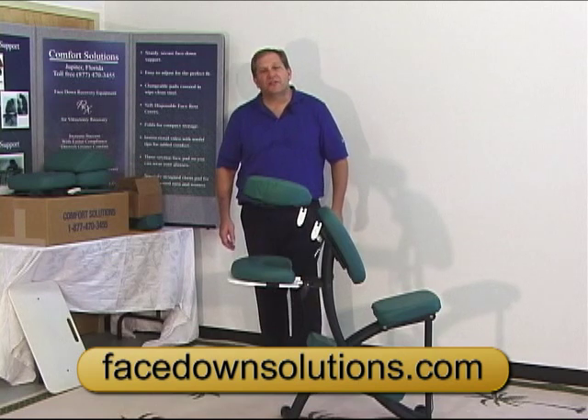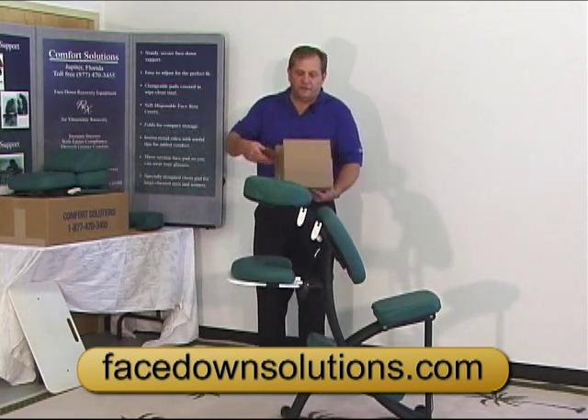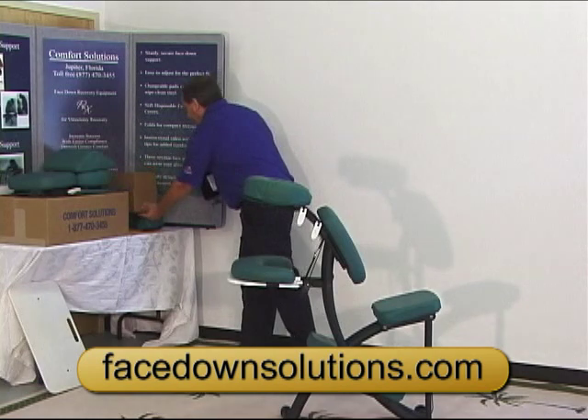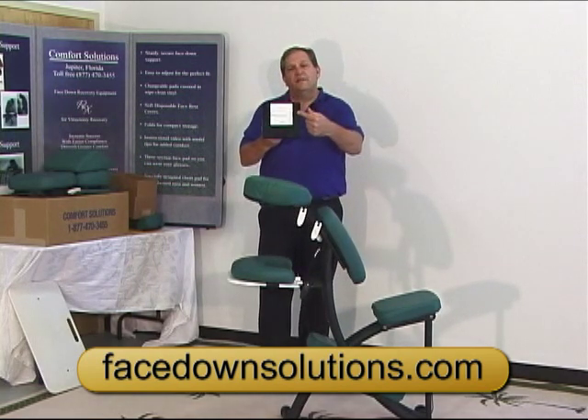Tom Russo here again to show you how to use the Comfort View mirror. In this box you'll find the Comfort View mirror and your disposable face rest covers. The Comfort View mirror has instructions printed right on it.